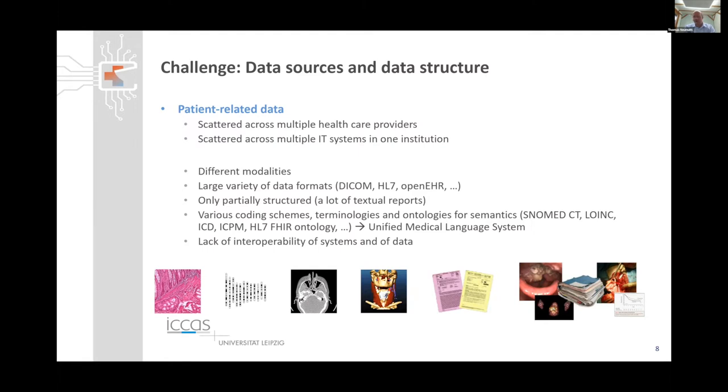So inside of the healthcare providers, for instance inside of the hospitals, we have a lot of different modalities that participate in the patient treatment process. For instance, we have all the radiology devices, the anesthesia or monitoring devices, and so on. And even they don't share and integrate their data. They all report, they all document, but they all store these data in different systems.